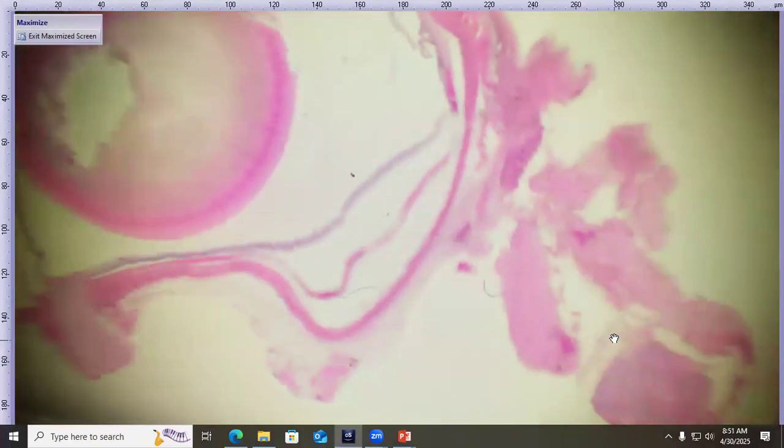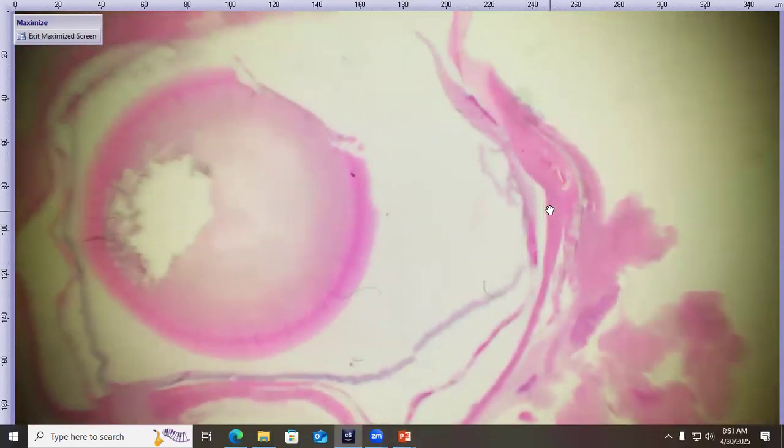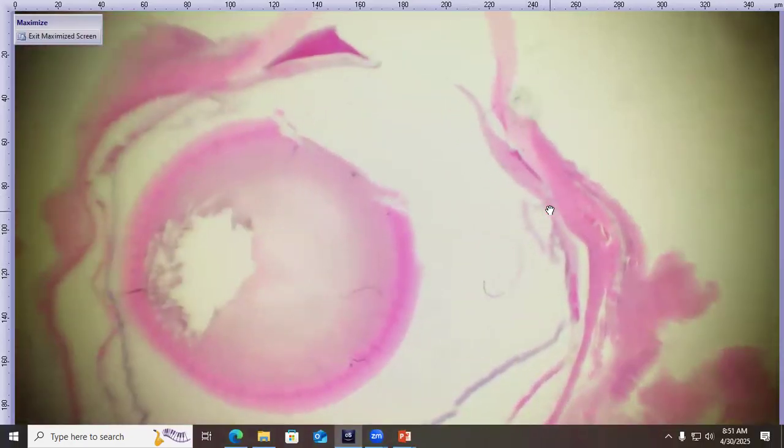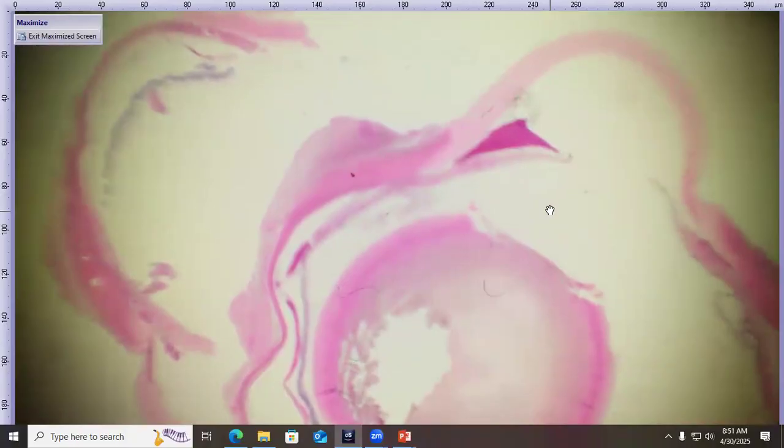So there was a little bit of some conjunctiva here on orbital tissue on the dorsal portion. They didn't submit the stick. It wasn't there, which is a little bit sad, but they wanted the stick. I don't know. The dog worked really hard for it. Maybe they give it back to the dog. Hopefully not.